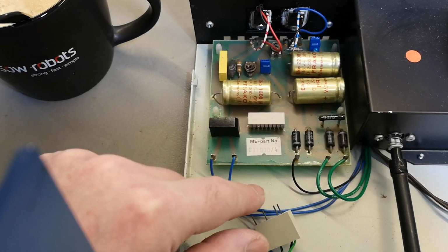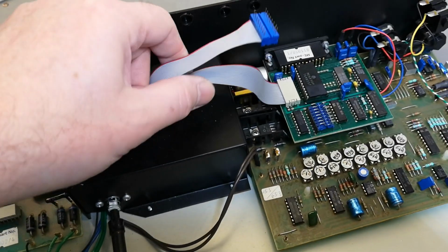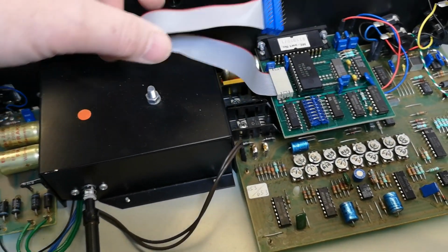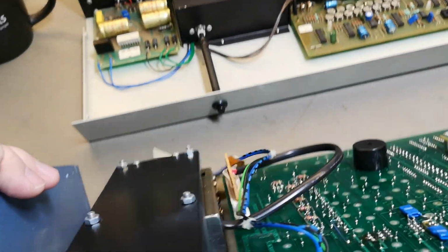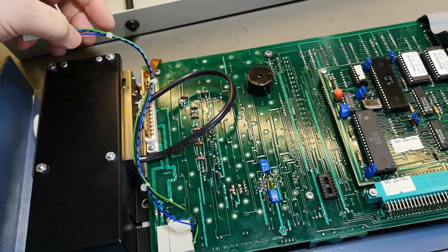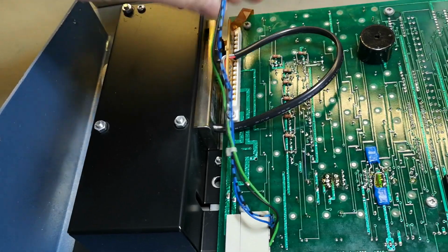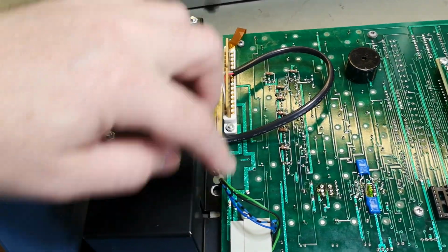And ME is Madsen Electronics, and then there's a part number for the different boards. And that will be the serial interface and probably all the different frequencies or levels or some stuff like that. A little bit of power supply. So here is the printer. I'll disconnect the... I hope... No, it is not. Here is the printer interface. Oh, there's a lot more to it. So that's quite a big board. We got a little bit of modifications here. So that will be power supply to the entire board, right? And this is the printer that's just running and running.